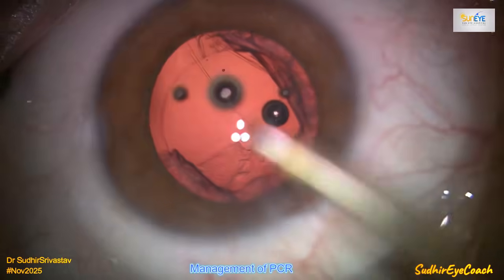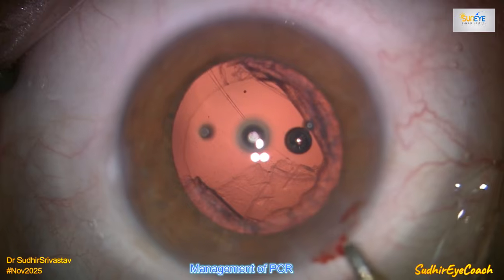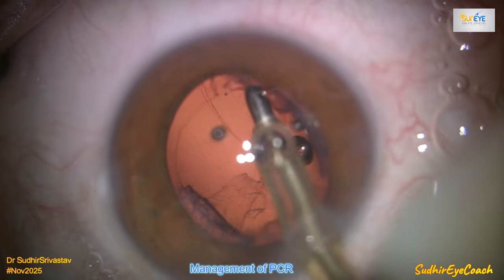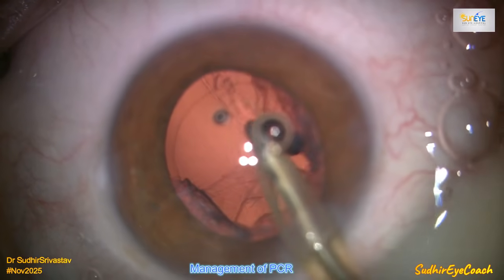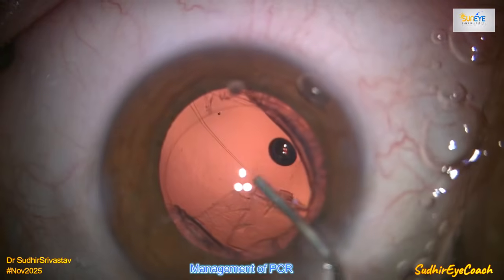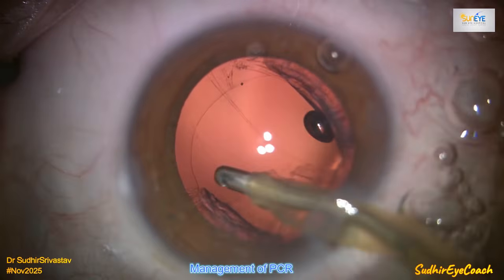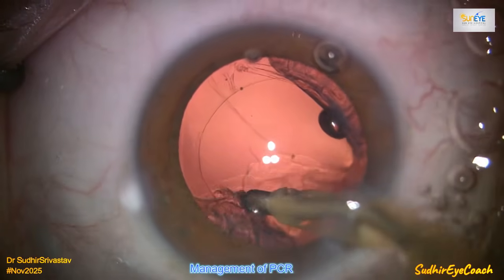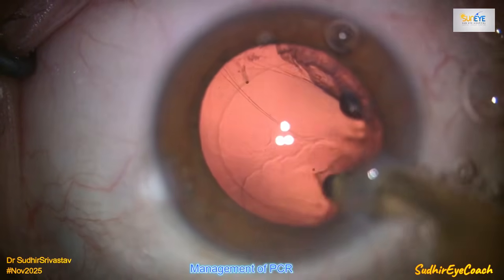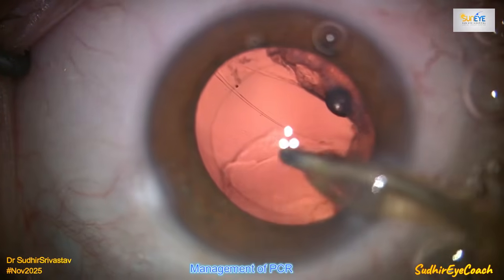Always refill the anterior chamber with viscoelastic to maintain the space and provide a tamponade effect so that the vitreous doesn't move forward. Fortunately, there was no vitreous displacement, so I decided to reduce the bottle height and reduce the intraocular pressure settings to the minimum, and with the visco tamponade technique and gradually with dry aspiration, I started removing the cortical matter, and successfully I removed a chunk of cortical matter which is quite away from the rent.